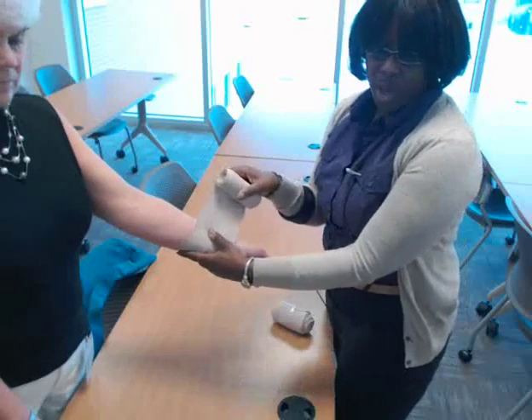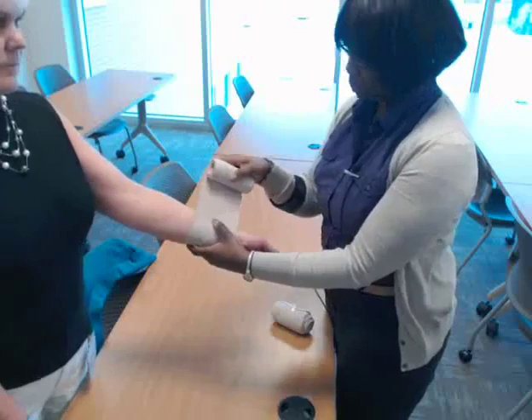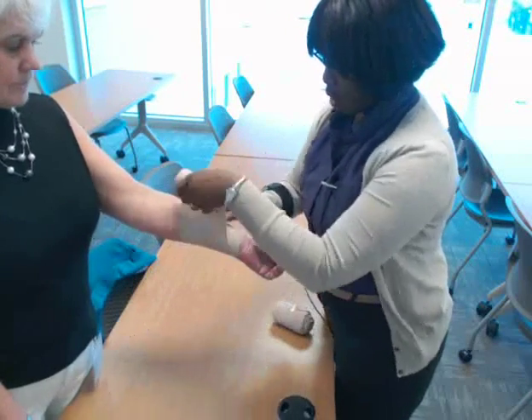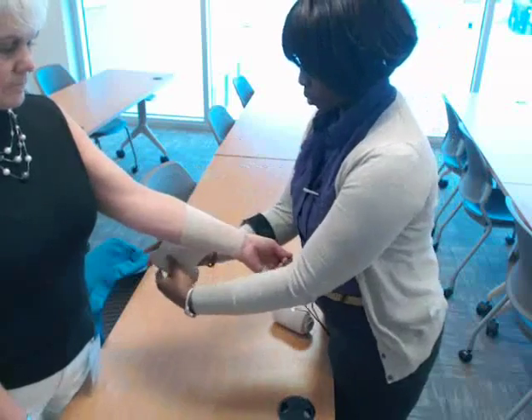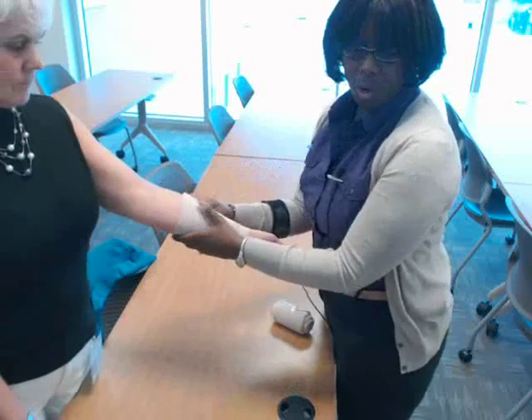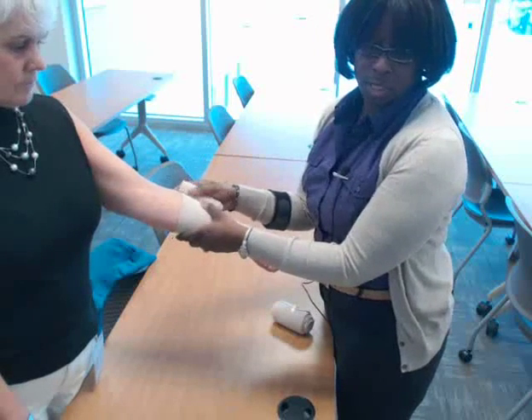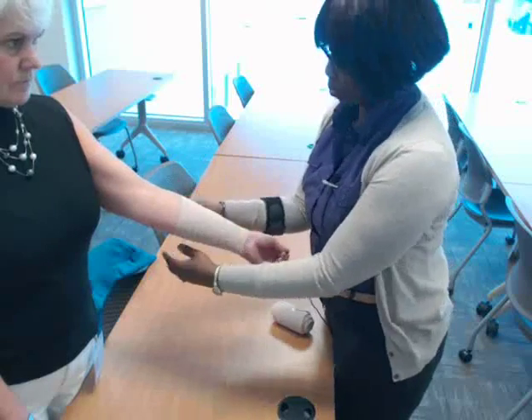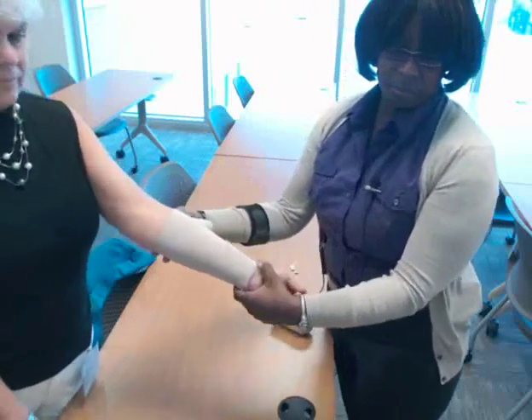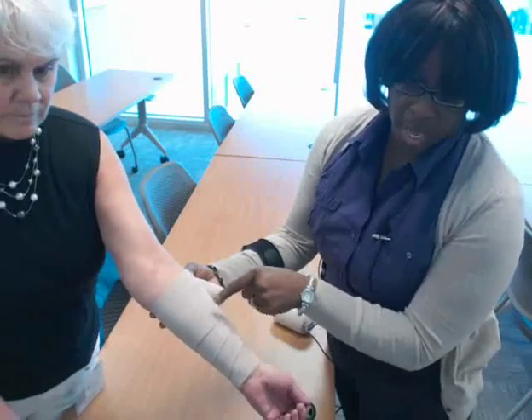To do the spiral, you want to go halfway up with your turns each time. Here I'm going to come halfway up the arm. As you go, you want to give a little tension each time. You don't want it to be too tight, but you don't want it to be too loose either, because the whole point is to provide support. You can see the spiral turns on that wrap — each turn is halfway up.